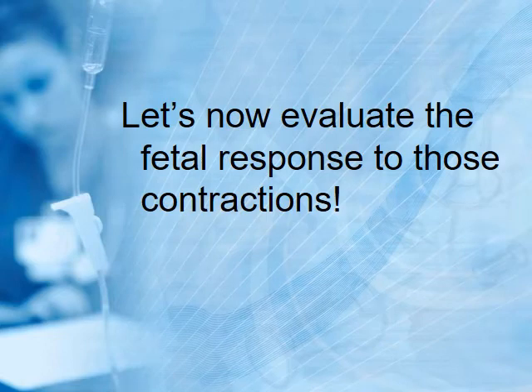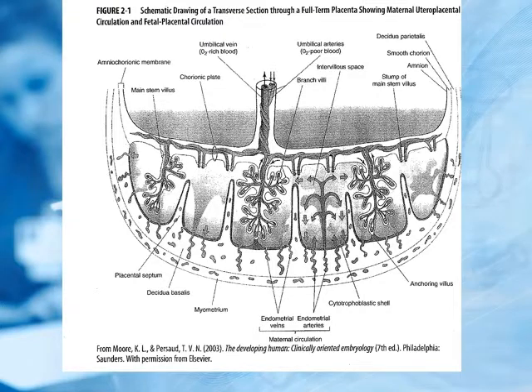So now let's evaluate the fetal response to the contractions. The first thing to understand with the fetal response is the fetal blood supply and what affects its ability to have adequate oxygenation and tolerate contractions.